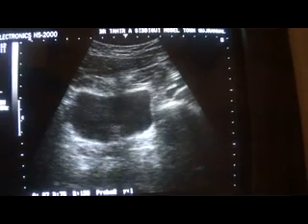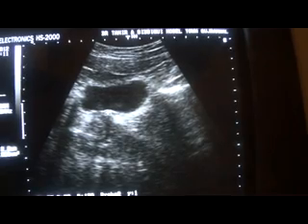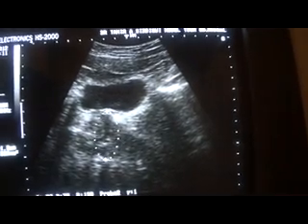To see the prostate, I move the probe downward. Using a 3.5 MHz probe transabdominally, this is the prostate and this is the central zone. The black area is the prostatic urethra, and here where the star is blinking you are seeing a tiny concretion which is giving posterior shadow. The cause of the urinary complaint — incomplete evacuation of the urinary bladder — is this concretion seen in the transverse section of the prostate in the prostatic urethra.